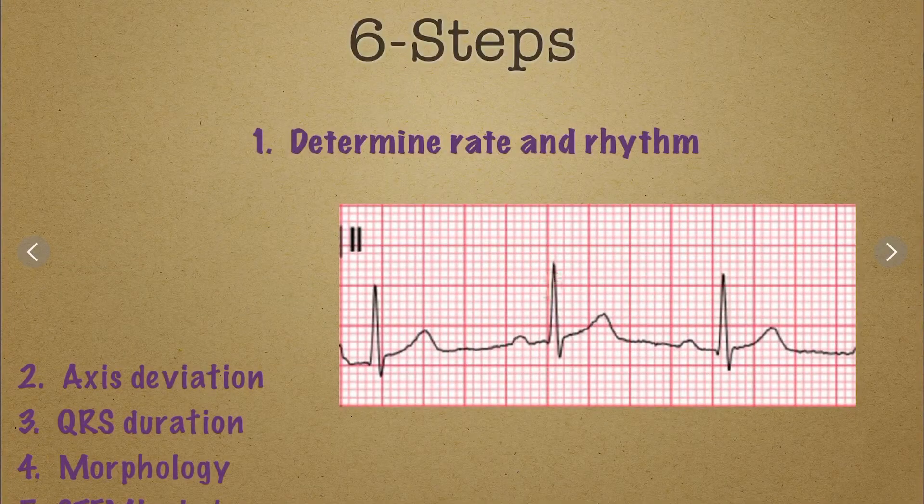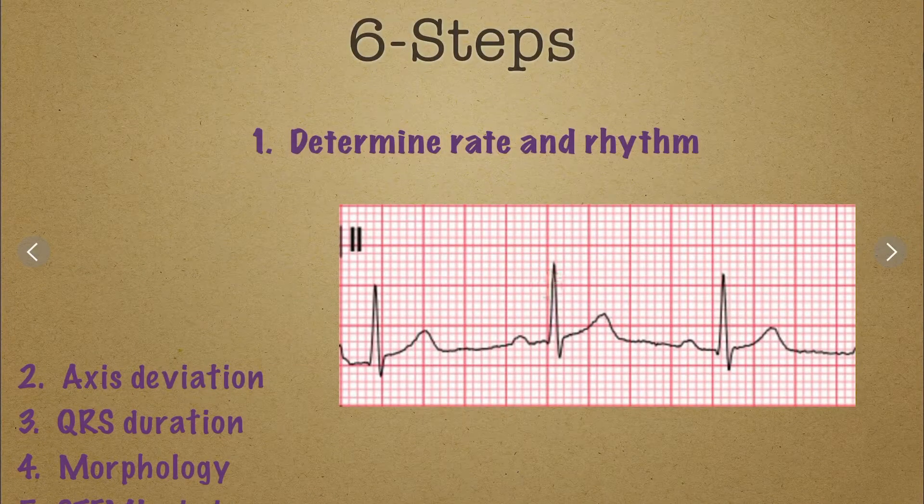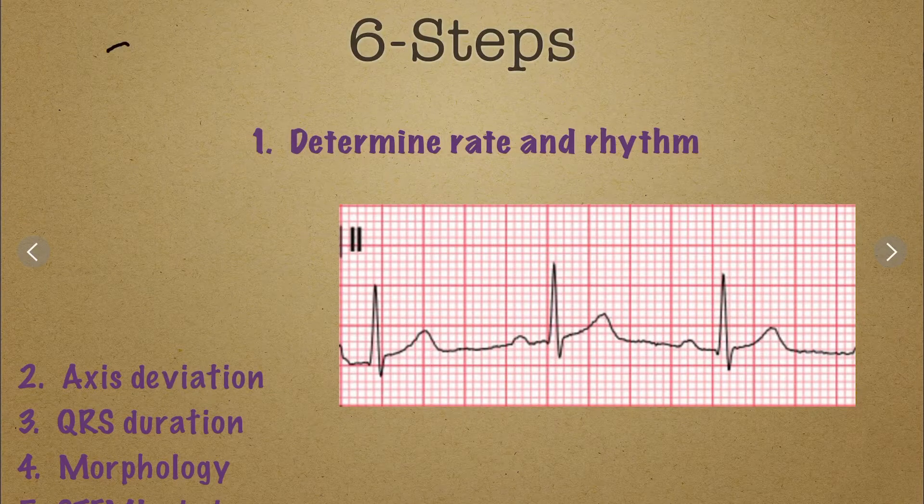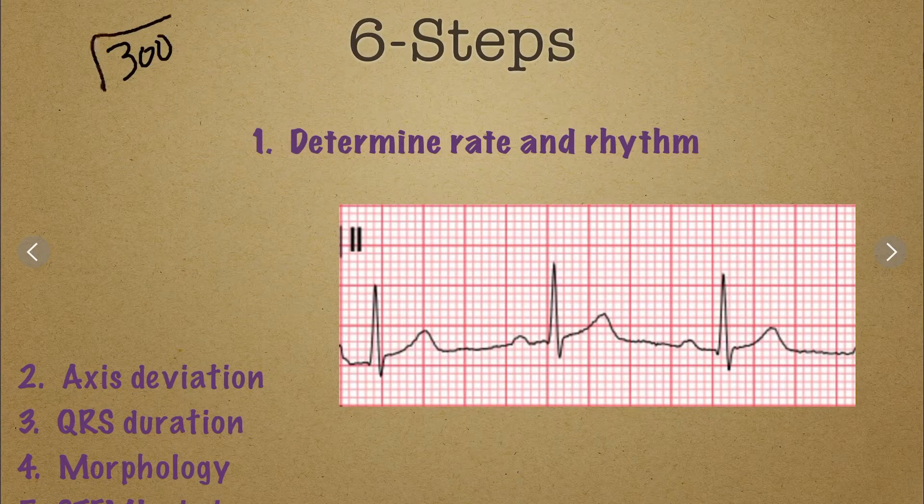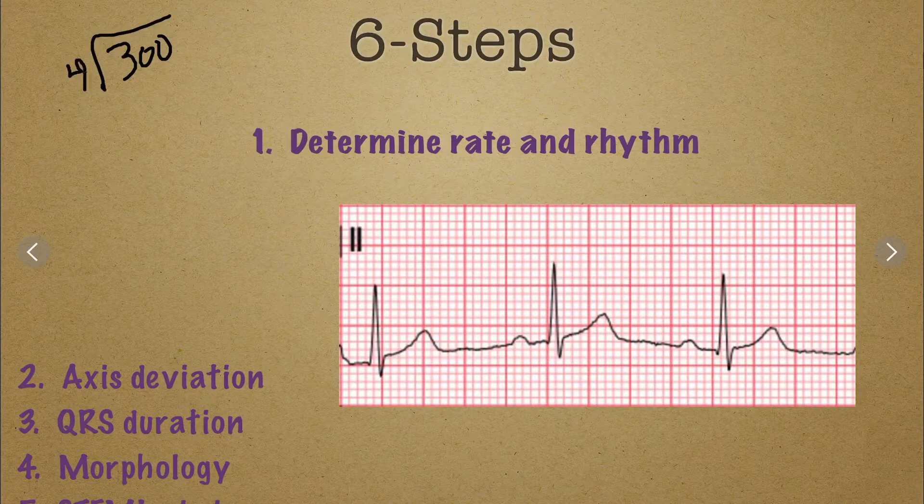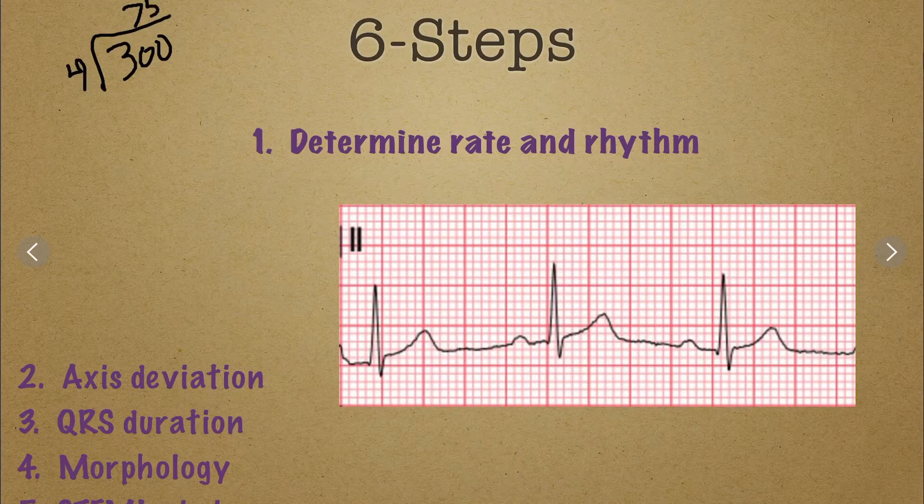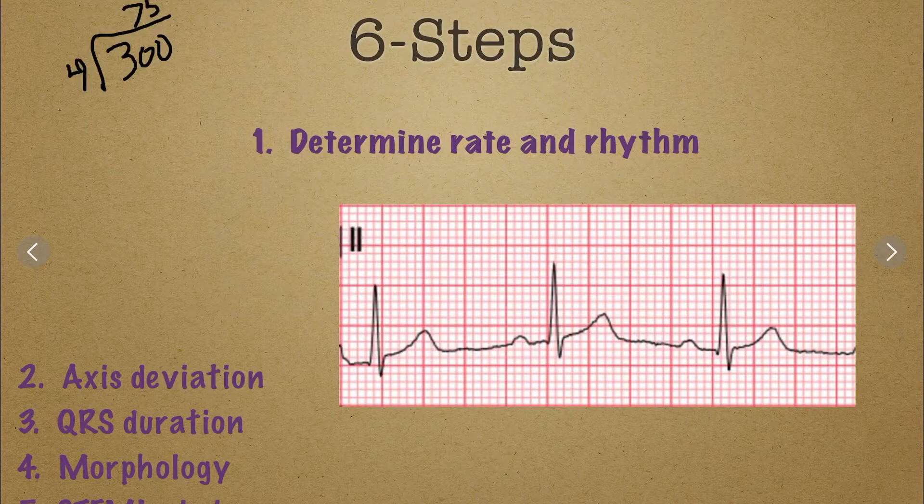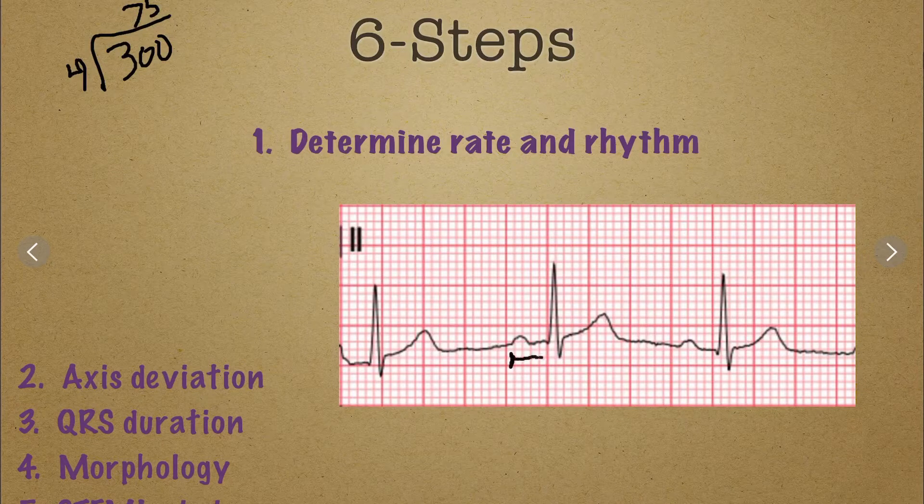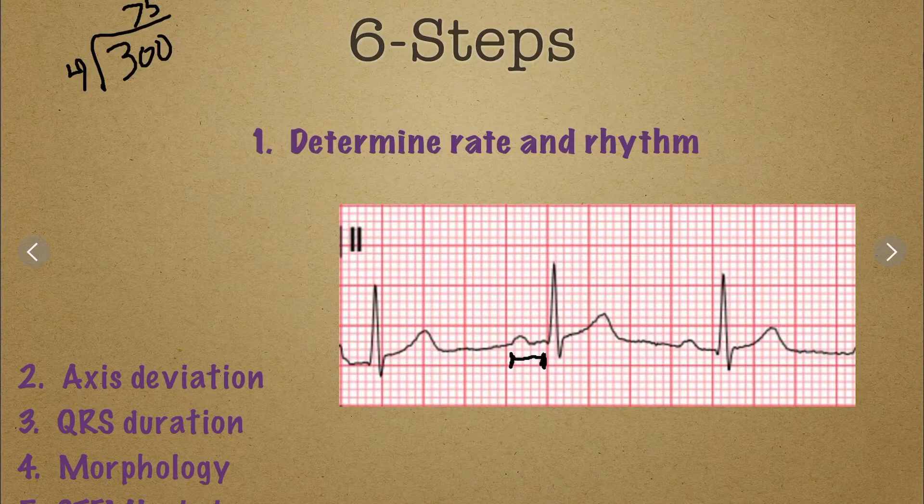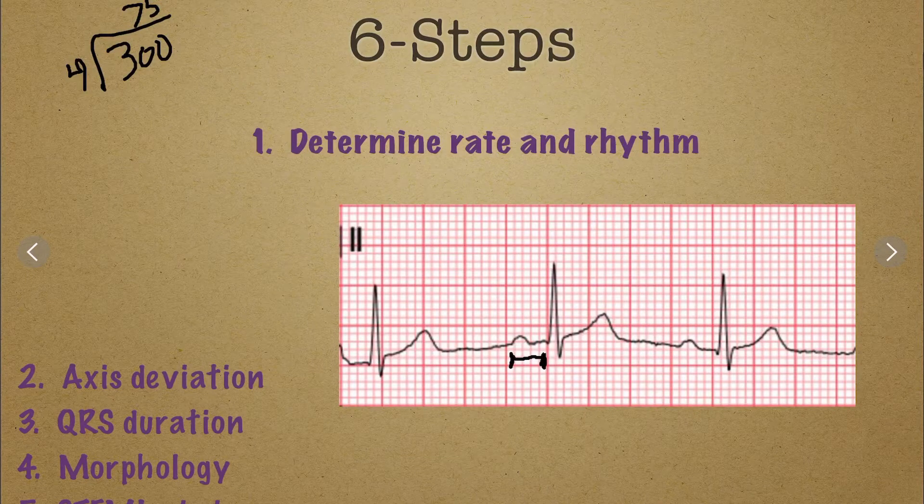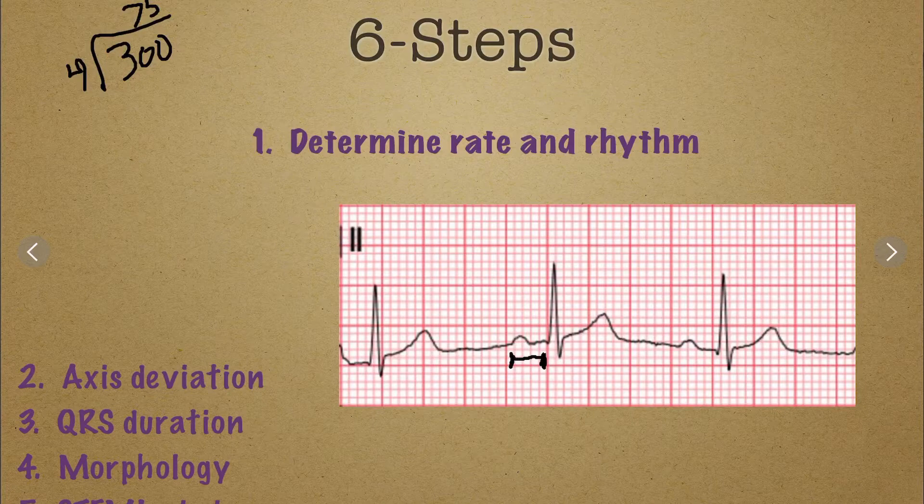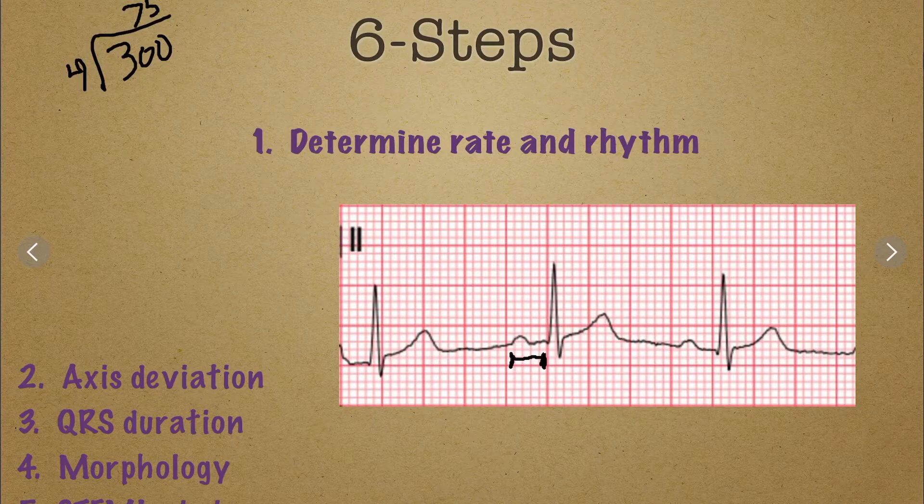two, three, four, so about four, just a little bit over four large boxes. So if I take 300 and divide that by four, I end up with 75. So that's 75 beats per minute. This is probably a three-second strip so it looks about right to me. PR interval looks pretty good. I have one P wave for the QRS. QRS complex looks normal and it's fairly narrow. I would just call this a normal sinus rhythm.